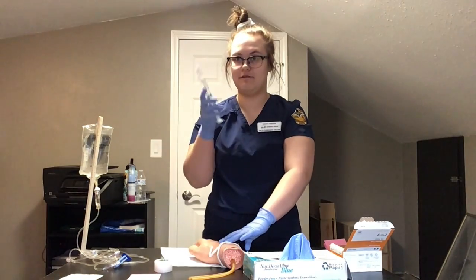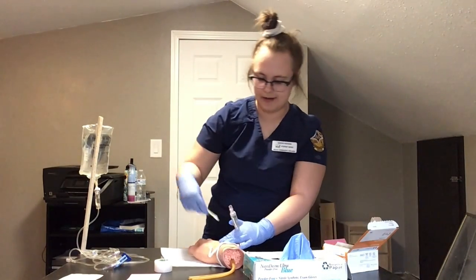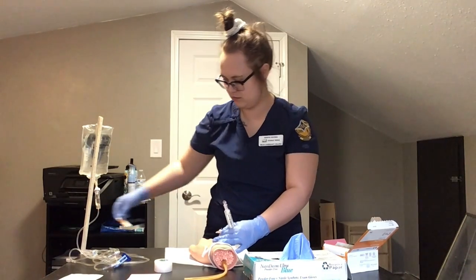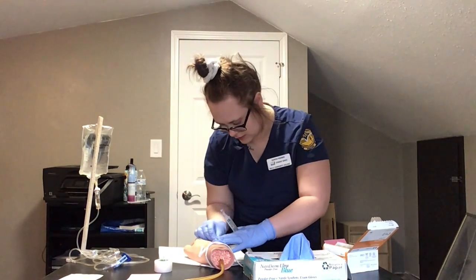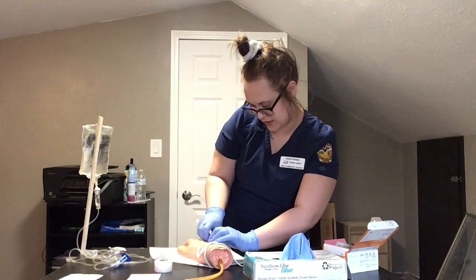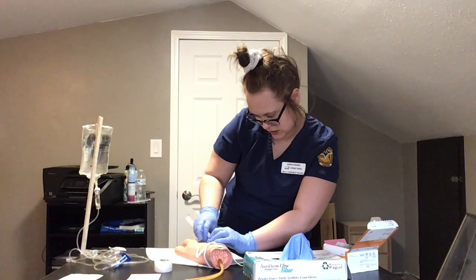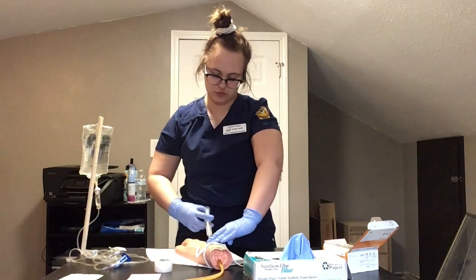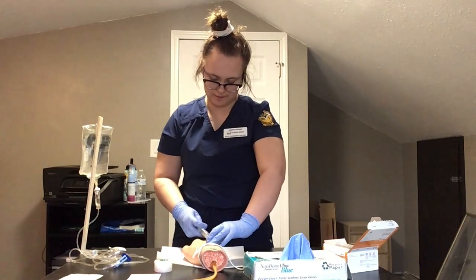Then I'm going to get my IV lock, take that cap off, get another alcohol prep pad, cleanse, put that on there. And then I'm going to flush the IV with 1 to 2 milliliters of saline.